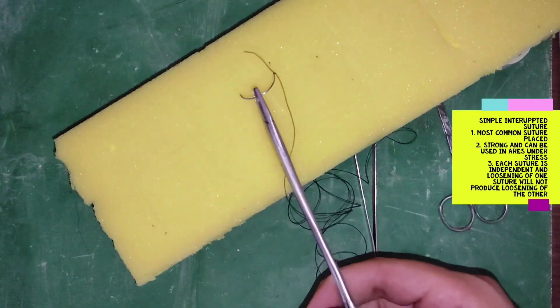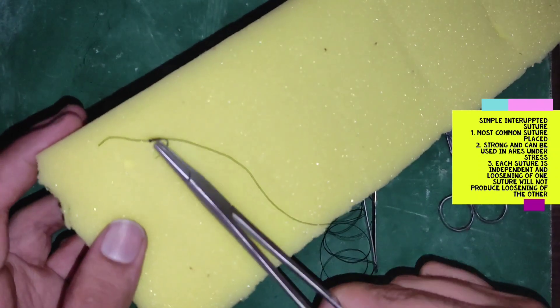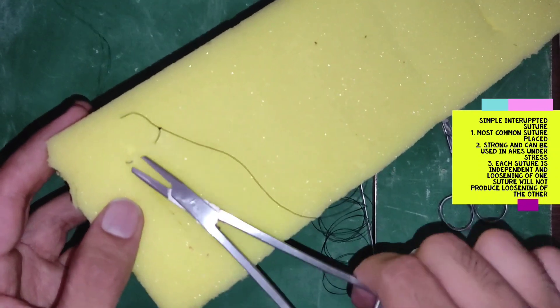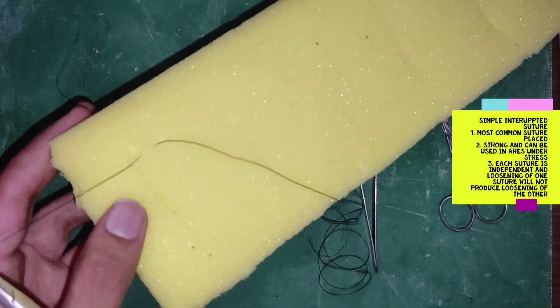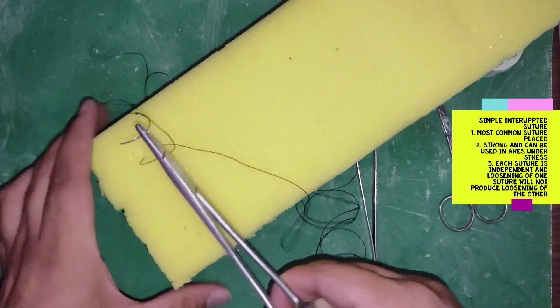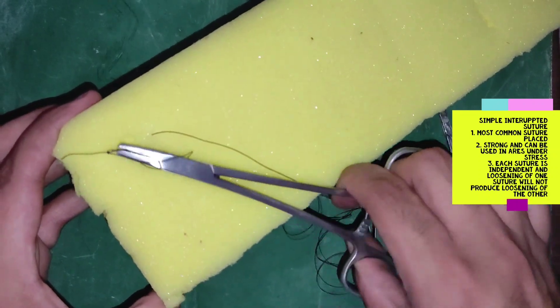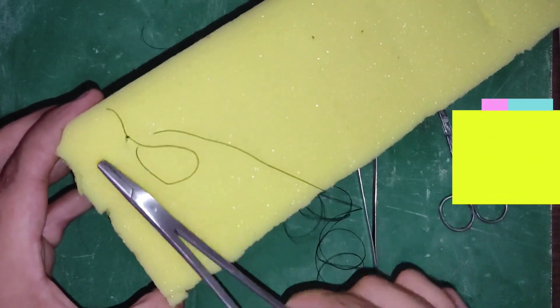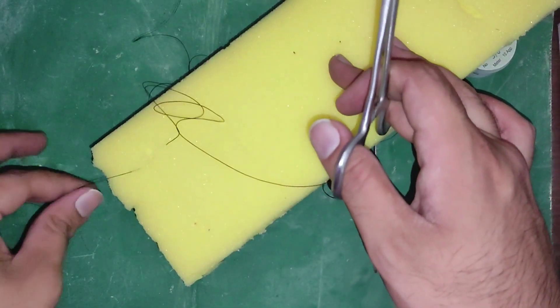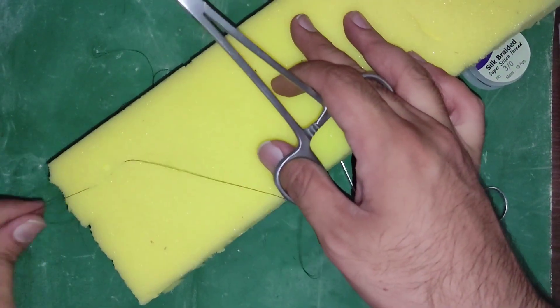The needle should enter the tissues perpendicular to the tissue surface, and the needle should be passed through the tissues along its curve. Remember, the suture should be passed at equal depth and equal distance from the incision on both sides.